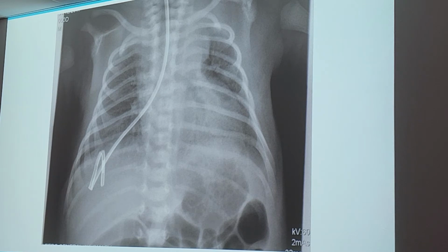So most likely what happened is the patient was either not swallowing when this happened, or they completely forgot to instruct the patient to swallow. So it ended up in the trachea and then down to the right lung. That hurts too, I'm pretty sure. Oh, yes. They have to pull it out. Meanwhile, the poor patient's gagging and coughing and in pain. Does blood come out? Blood shouldn't come out unless there's something else going on.